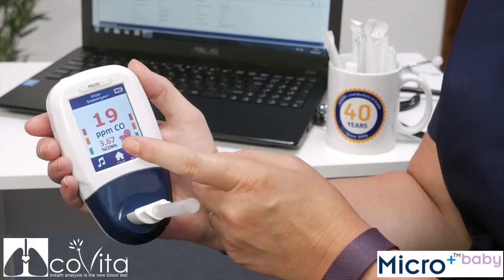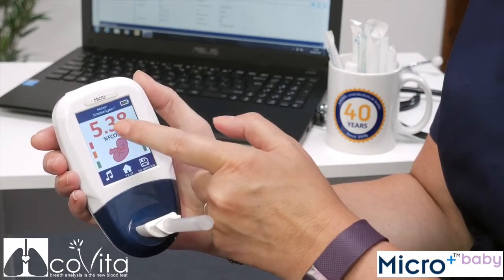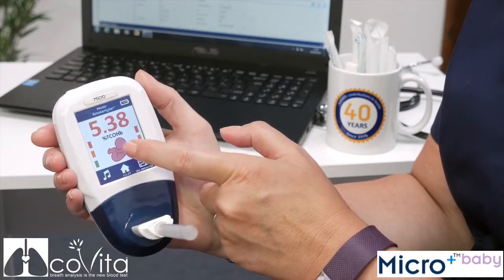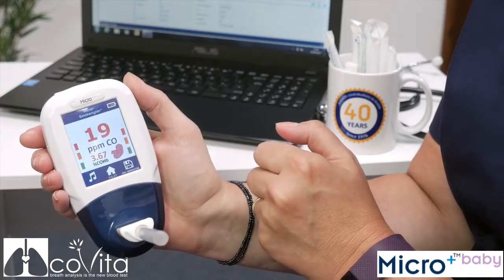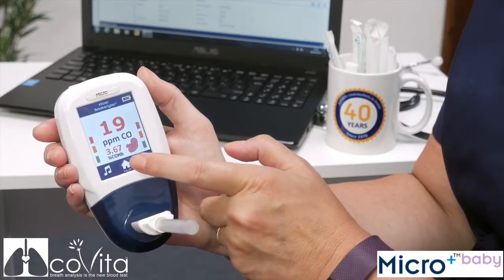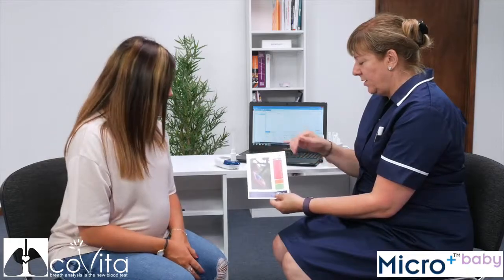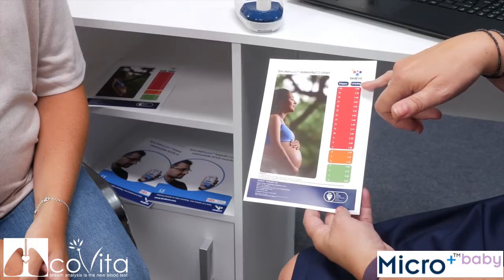Click on the baby icon to see the CO fetal calculation. Click the icon again to return to the results screen. When the test is finished, you can save the reading to the patient's profile or return to the home screen. Readings and results can be interpreted using the Maternity Smokerlyzer CO chart.